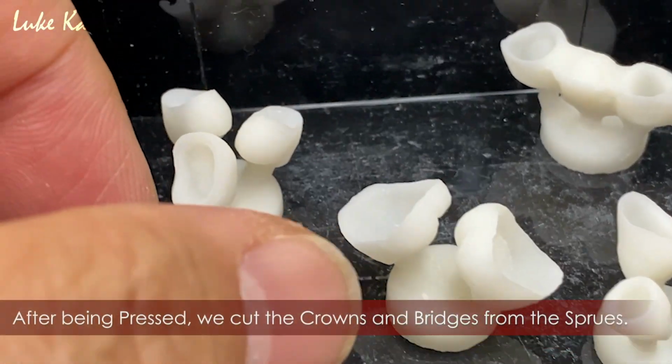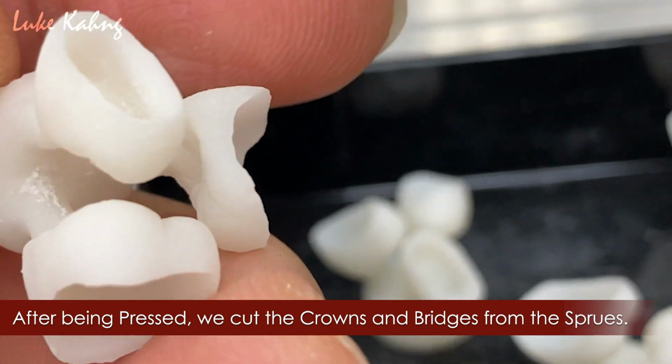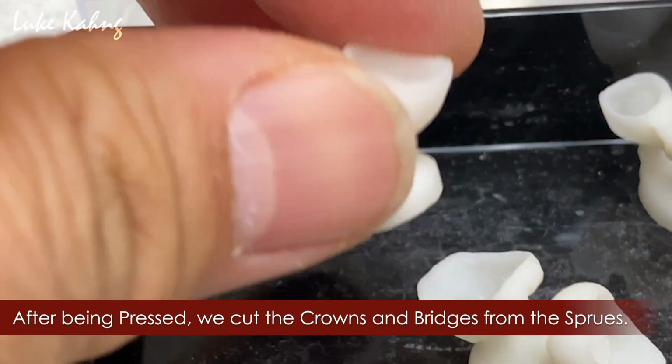Okay, so after we divest it from the index, press it. Here is the final before we cut it to fit to the model.